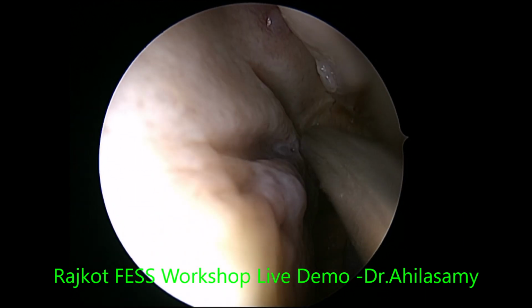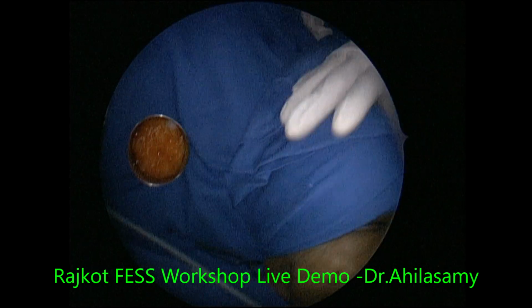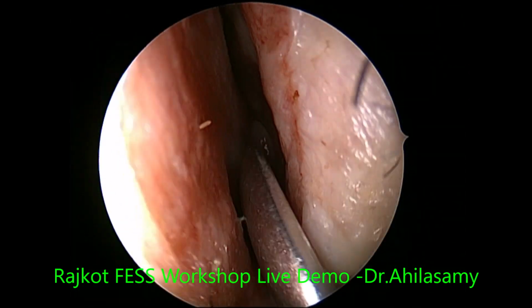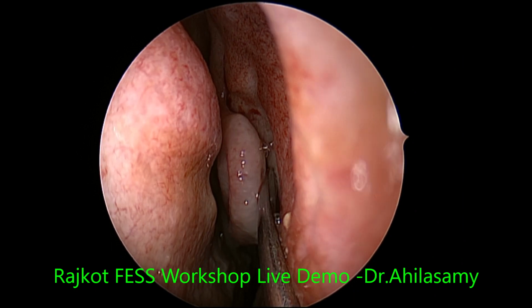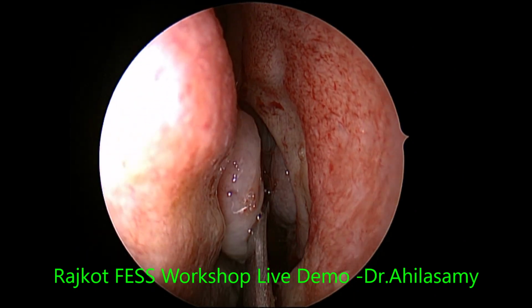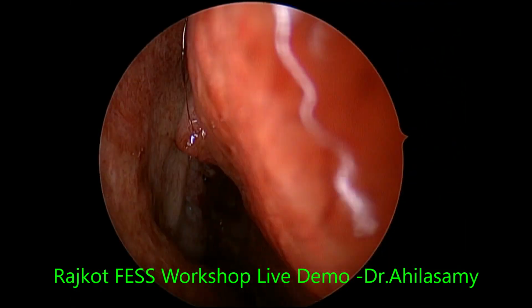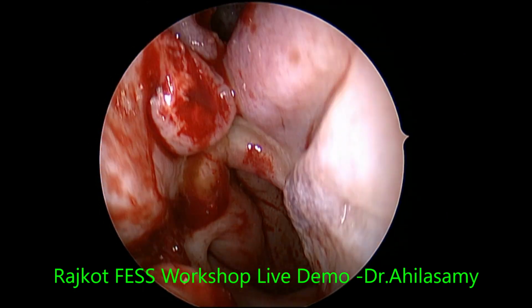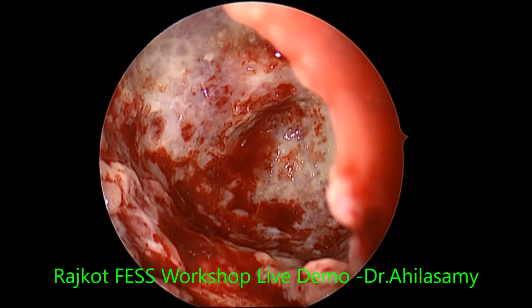So I don't want to do unnecessary things. I am a man who doesn't do unnecessary things. Give me the elevator. I fractured the middle turbinate a little. We didn't do any surgery. It has gone a little lateral, so I will push it back a little. Be careful. So hardly any trickle. Totally dry. Very nice demonstration, sir.